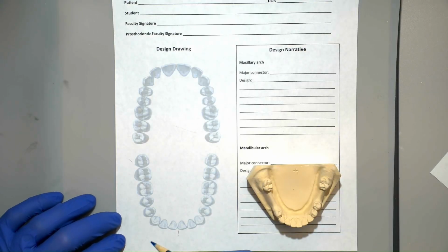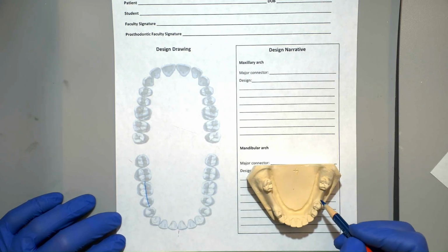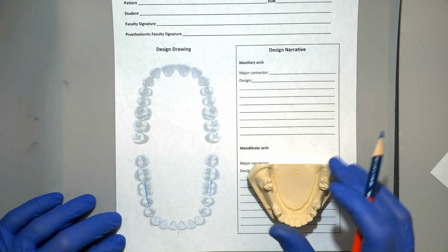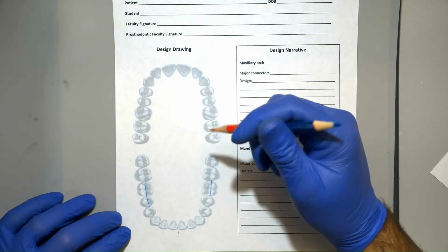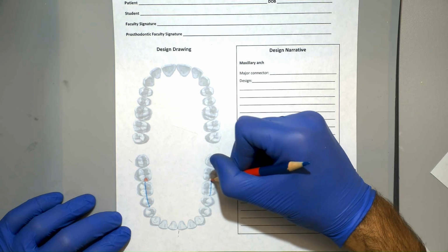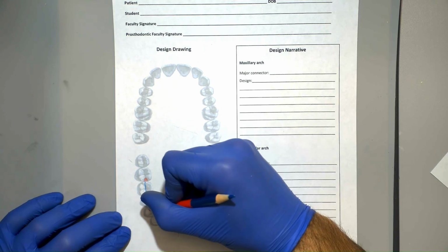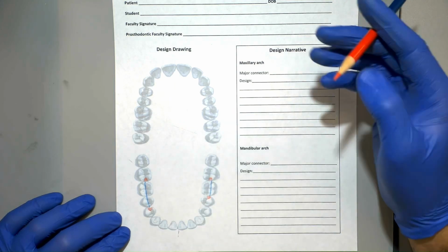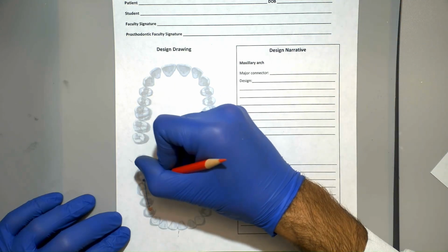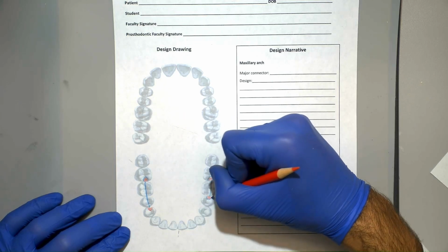I use the cast to identify which teeth are missing and mark them with a blue line going through the center of the missing teeth. I'll now use the red side of the pencil to draw all the different rest seats on all the teeth. I'll now go ahead and switch over to the blue side of the pencil, and I'll outline each red rest seat with a blue outline representing the rest.